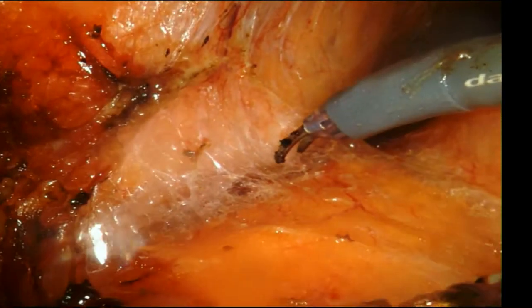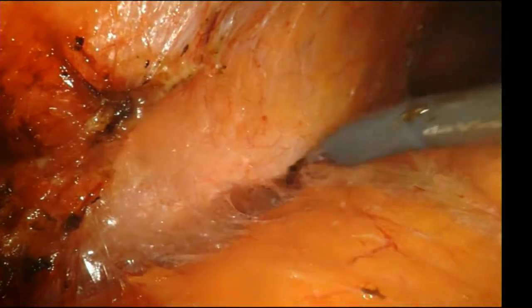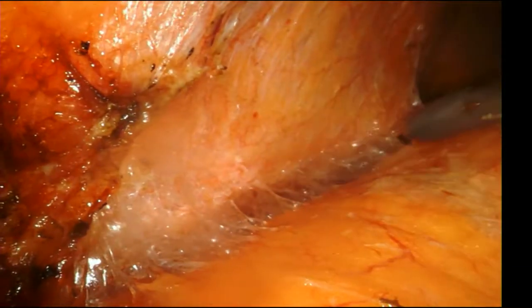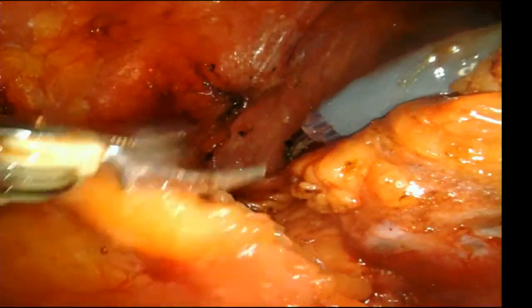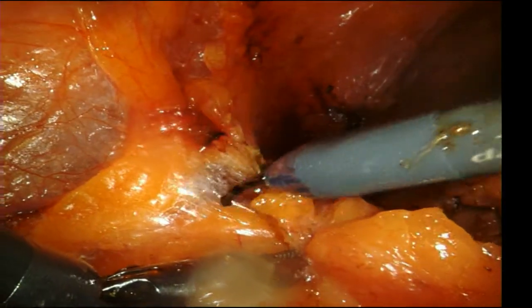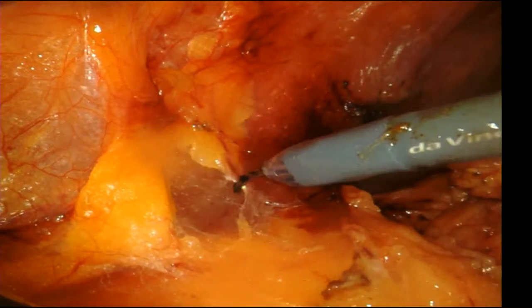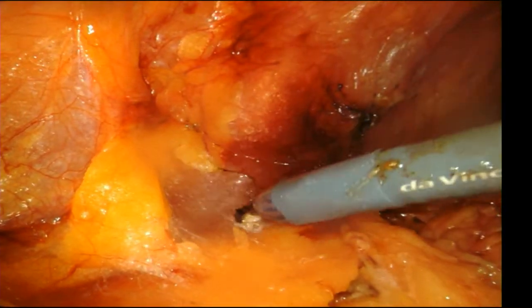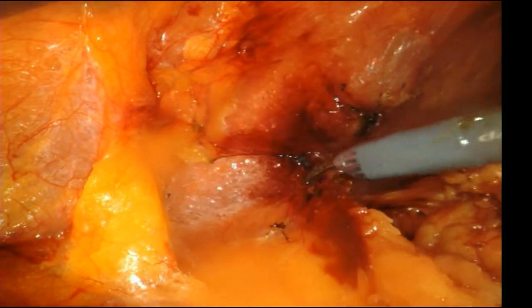And the reason why is because when you come in retro, you're coming in from the upper pole looking down, and sometimes you're really close to that lower pole, especially on the right side. The right kidney, of course, is going to be lower in the abdomen than the left kidney, and especially if somebody has a big liver, you may put your ports in for the retro and then find that you're right on top of the lower pole, or the lower pole may even be further down than you are. And that's a nightmare when that happens.